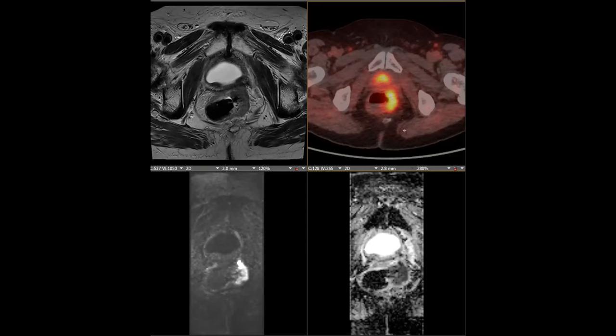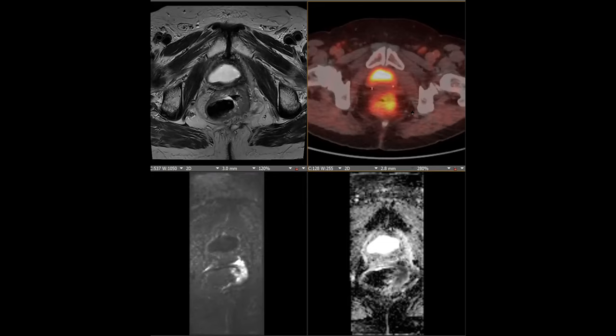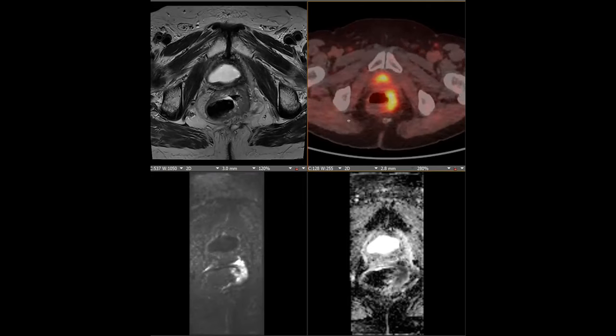Very cool. And you did not find the prostate cancer recurrence? No, there's nothing. I didn't see anything in the prostate bed. Yeah, that is tricky though with the bladder being bright like that. Yeah. But anyway, cool. Thank you. It was a pretty good case, I thought.